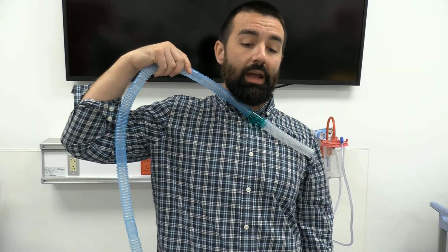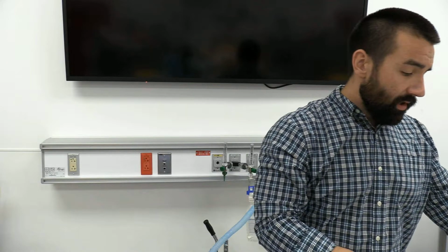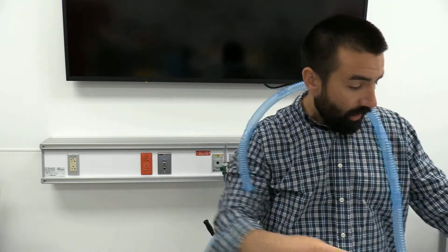So if I have somebody on a T-piece with a lot of frequent suctioning, first off, I'll try and consider them for a trach collar if they're clearing stuff on their own. But if they need a lot of suctioning and they're on a T, you want to make sure it's draining down so it doesn't occlude. But what I'll show you is, if somebody's got a bunch of frequent secretions and we need to suction, something called an inline suction catheter.